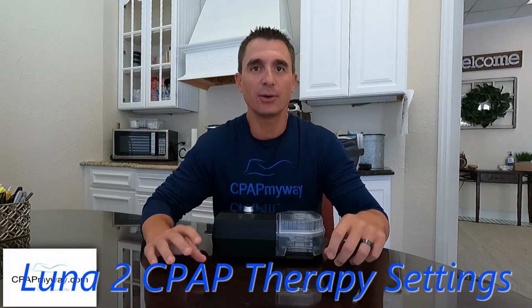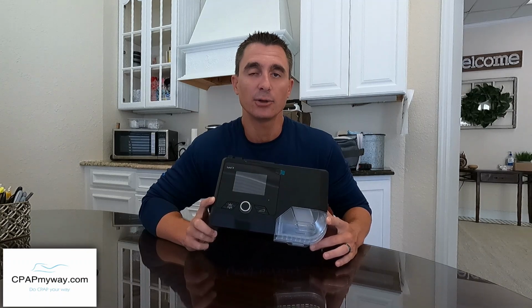Today we're doing a brief video to show you how to adjust the therapy settings in your Luna 2 CPAP. This is an auto version. I'm showing you the auto because it's got both the options for CPAP setting and auto CPAP setting. So we'll show you both.